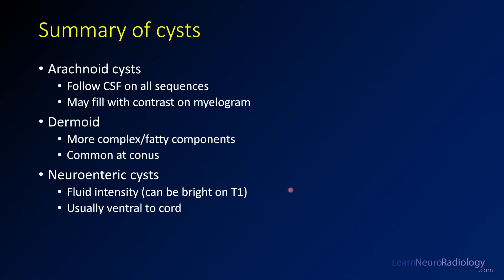In summary, we've seen three cystic lesions that can occur in the spinal cord. Arachnoid cysts follow CSF on all sequences and may or may not fill with contrast on myelograms, but myelograms can help delineate their margins. Dermoids are complex embryonal lesions with complex components, often containing fat, most commonly located at the conus. Neuroenteric cysts are usually fluid-intensity, can have some intrinsic T1 hyperintensity, and are located ventral to the cord. If you see lesions with cystic components and minimal enhancement, think about each of these three.